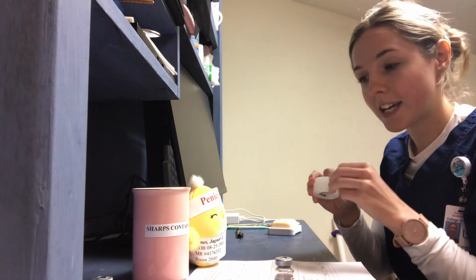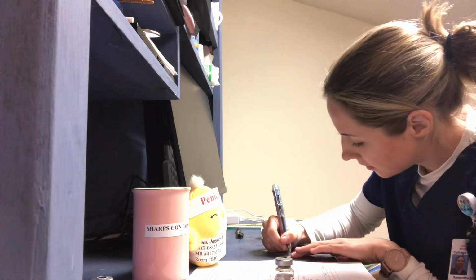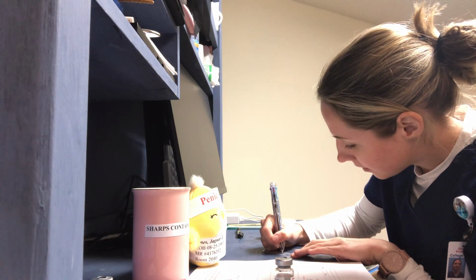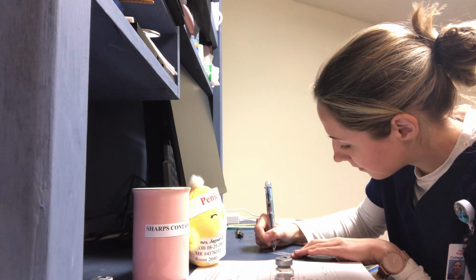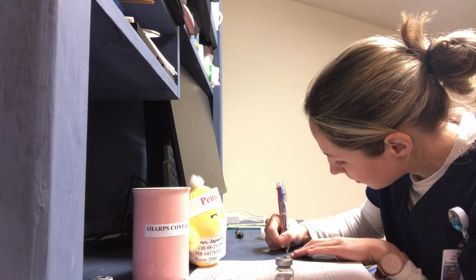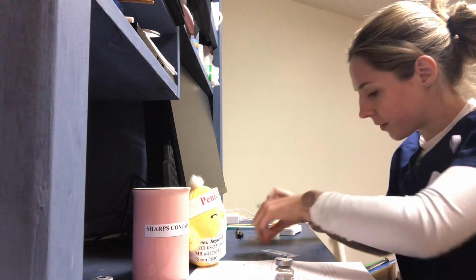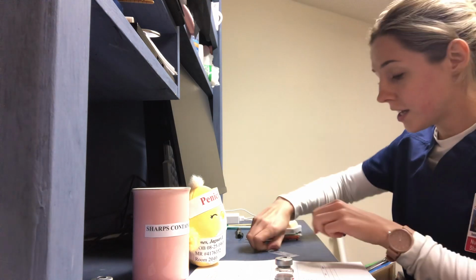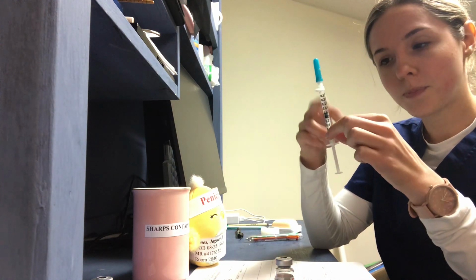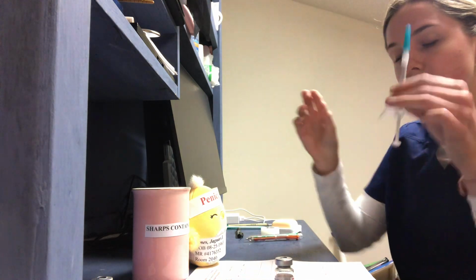I'm going to make my label here. I'm going to include the medication name, the dose, and the patient's name. So the medication name is heparin, 5,000 units, and I have 0.5 milliliters. And it's for Mr. Jaguar Jones. All right, make sure you write it clearly so that you can read it. Make sure when you put it back on your syringe that you are not covering up the amount of medication in your vial. All right, so we have that good to go.